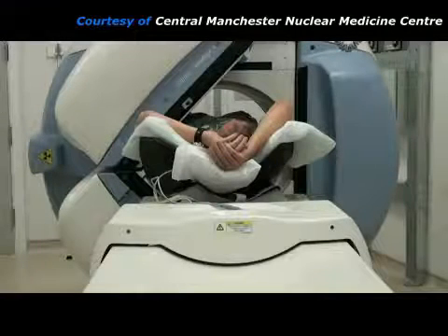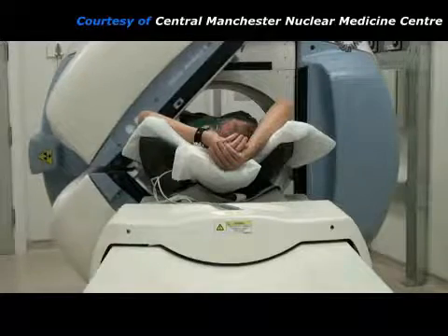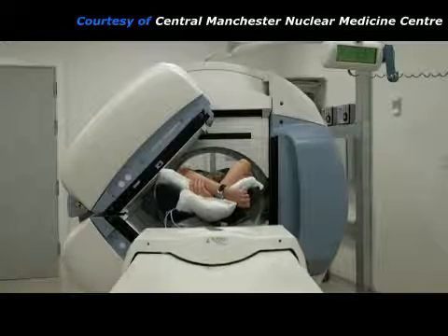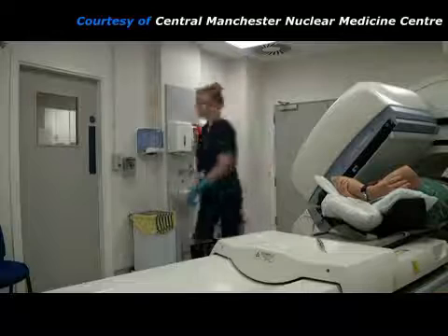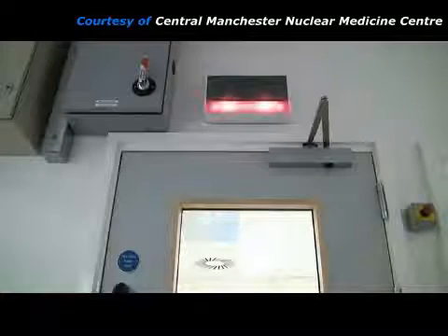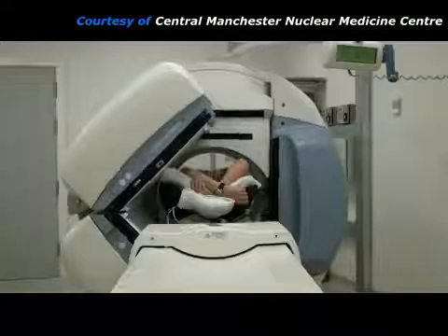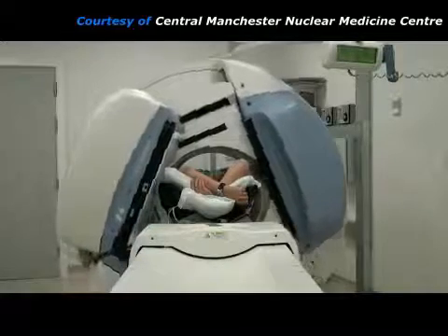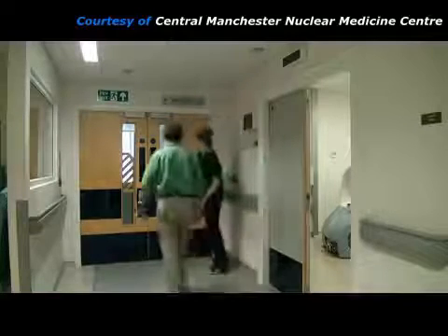After about 20 minutes, the gamma camera detectors will have taken their last pair of pictures and then move away from the patient. It is now common practice to take some further images using a low-dose X-ray CT scanner attached to the gamma camera. For this, the imaging couch has to move further into the gantry. During this part of the test, the practitioner will have to go into the control room for a few minutes whilst the X-rays are on, but she can still watch the patient through a lead glass window. The data from this low-dose CT scan will be used to apply corrections to the gamma camera images, which improve the accuracy of the test. After the test is finished, the patient is free to leave the department.